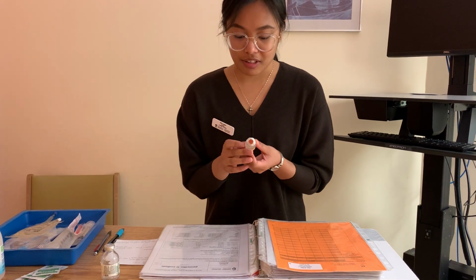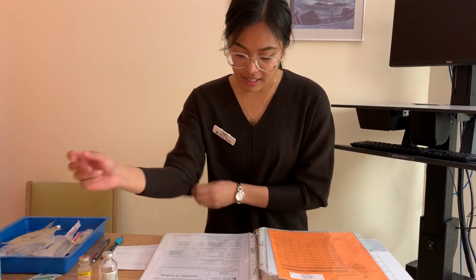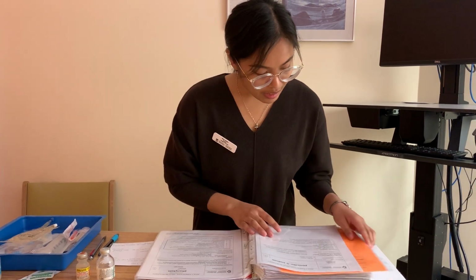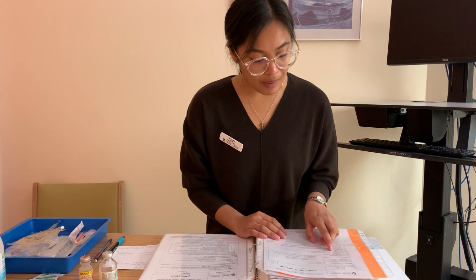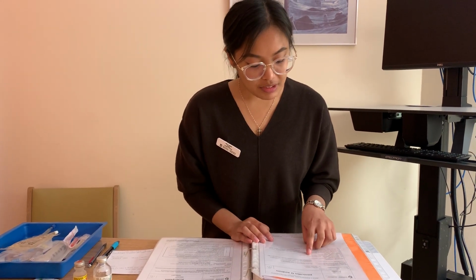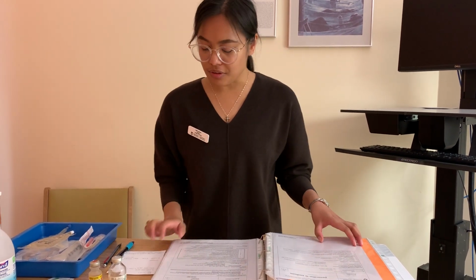And I'm checking integrity of the vial. It's 10 ml, there's no cracks, it's not broken, not expired, so I can use that. And I'm also looking at my potential hazards. So my patient can develop a rash, electrolyte imbalances, so dehydration, as well as hypersensitivity, so it can be an allergic reaction, and convulsive seizures. So you want to look out for those.